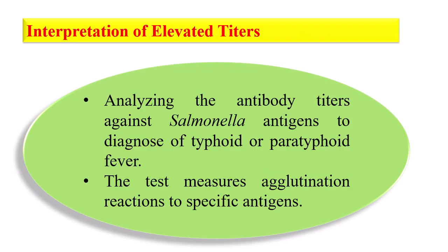Interpretation of elevated titers. The Widal test involves analyzing the antibody titers against Salmonella antigen to diagnose typhoid or paratyphoid fever. My dear friends, the Widal test analyzes the antibodies present in the serum of the patient against the Salmonella antigens to diagnose typhoid fever or paratyphoid fever.